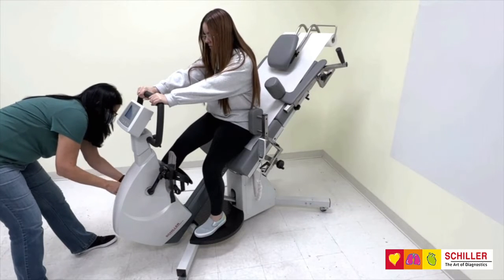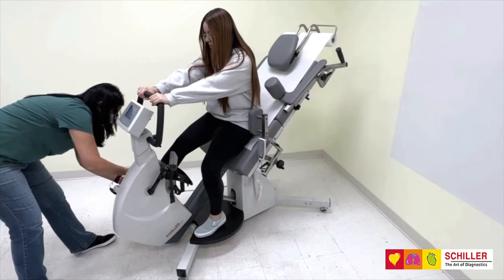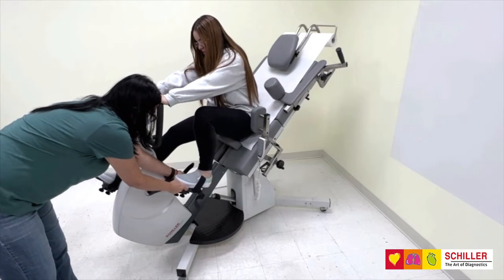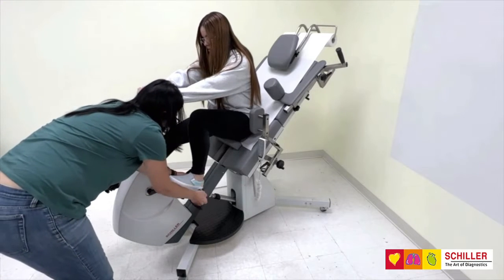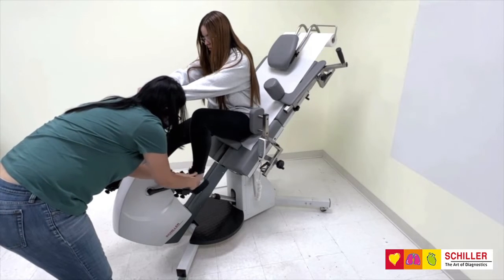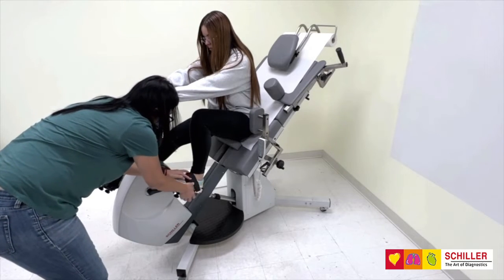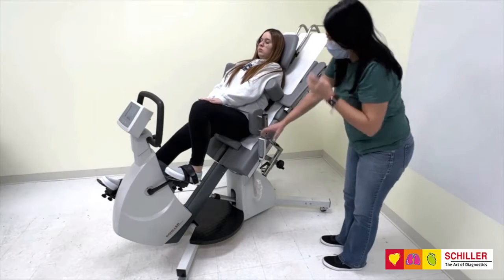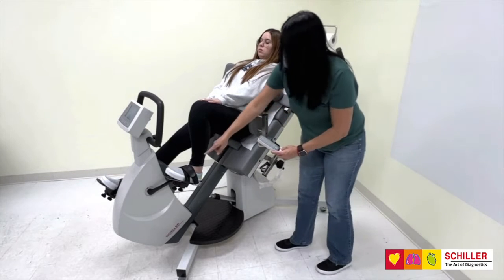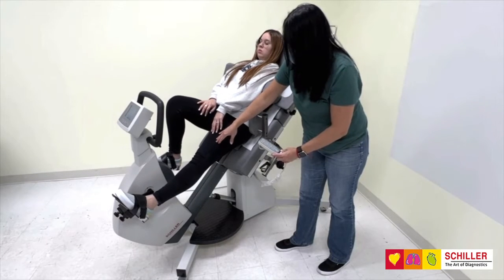With the patient seated on the adjustable seat, the patient's feet are secured with the pedal straps. Using the remote control, the seat height is adjusted such that the knee is at about a 90-degree angle at the highest position, and such that full extension is avoided at the farthest position.